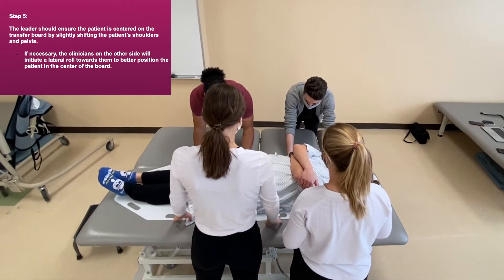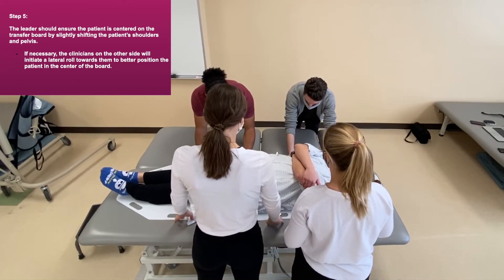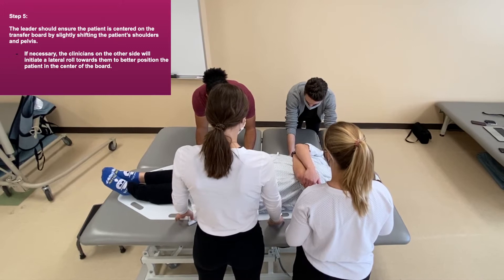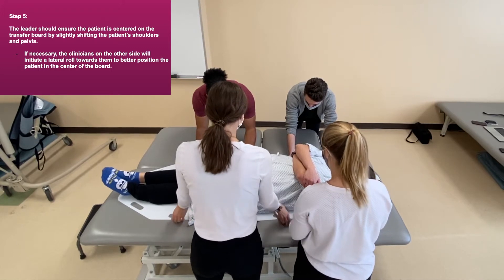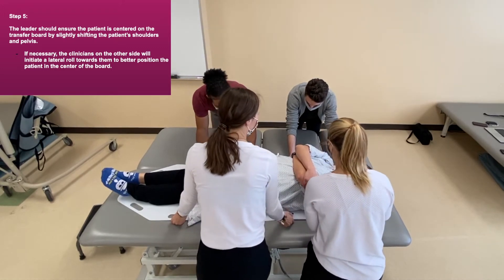If necessary, the clinicians on the other side will initiate a lateral roll towards them to better position the patient in the center of the board.